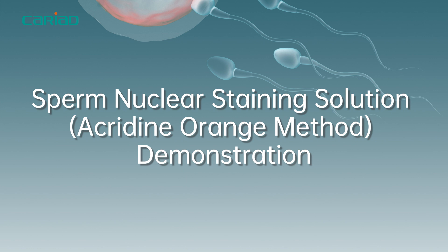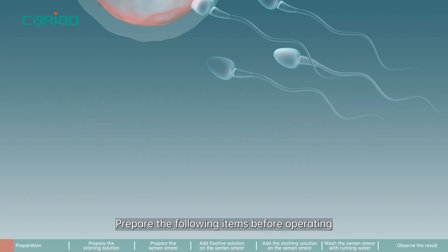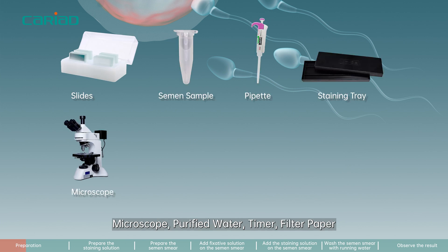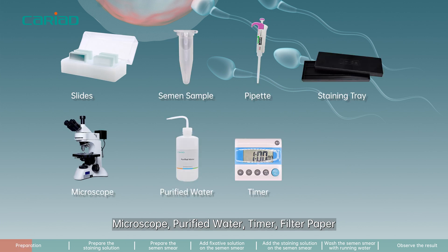Sperm Nuclear Staining Solution Acridine Orange Method Demonstration. Prepare the following items before operating: slides, semen sample, pipette, staining tray, microscope, purified water, timer, and filter paper.